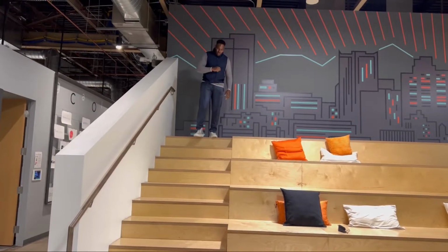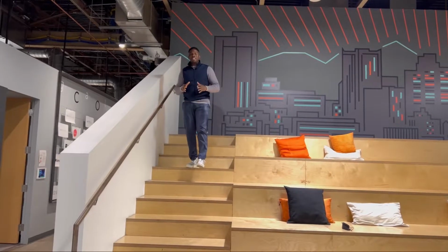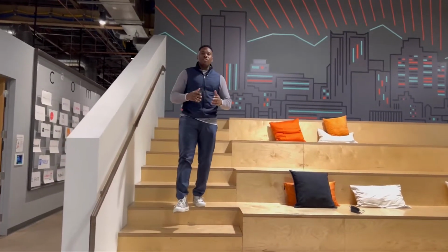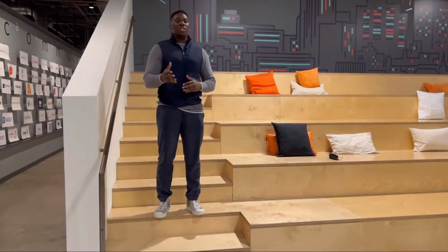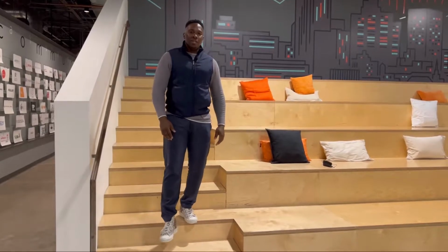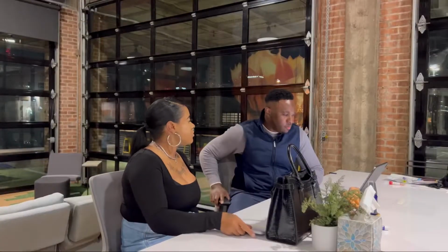Listen, we are going to talk and show you exactly what it takes to be a site technician. We're going to take you into the day, into the life of what you have to do in order to help individuals with getting their COVID test completed. It's a real simple process, and you're actually going to need some help to mess it up. So let's just jump right into it, because I know you're ready to get this knowledge, right?